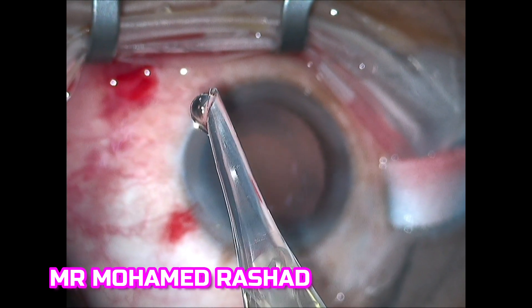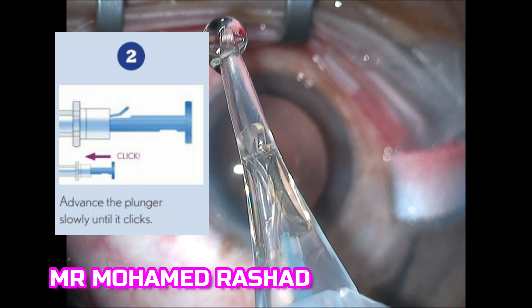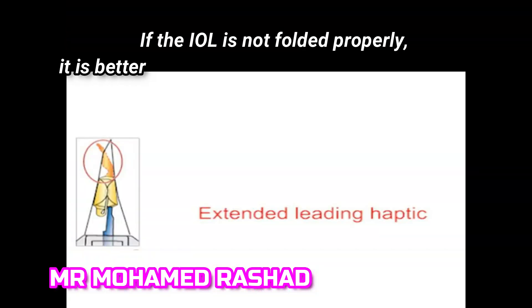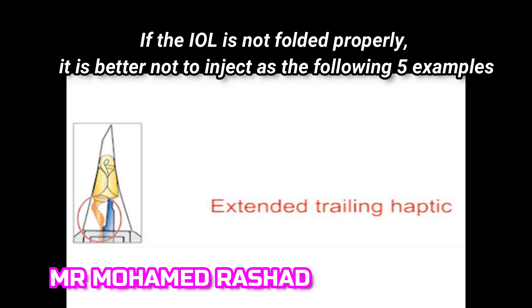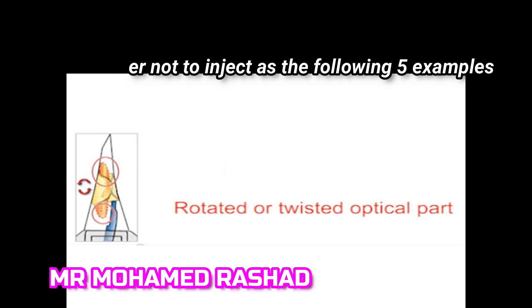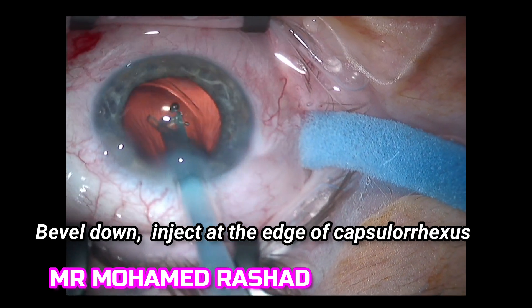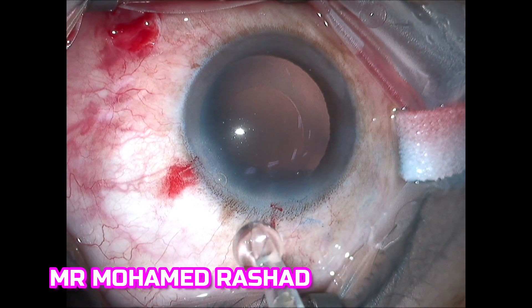No need to enlarge the wound as this IOL can go through the 2.2 millimeter incision. See the orientation of the lens when pushing the plunger until the click, then stop. Now the orientation is correct — the haptics are folded over the optic. Make sure you don't have extended haptic, incorrectly folded leading haptic, extended trailing haptic, or a rotated or twisted optic. If you have any of these, don't inject. When ready and orientation is correct, go through the incision with bevel down and inject at the edge of the capsular rhexis, keeping the plunger until the IOL is unfolded inside the bag.